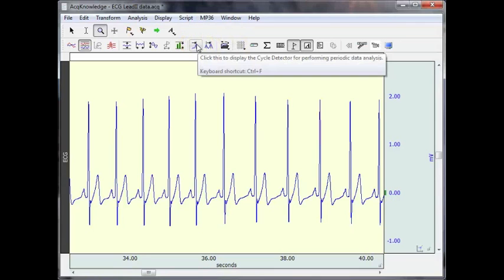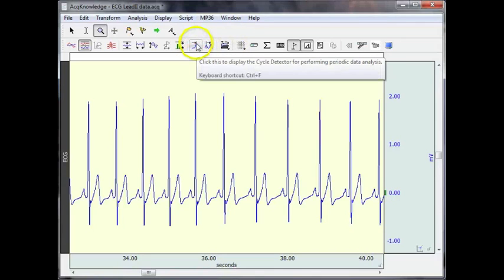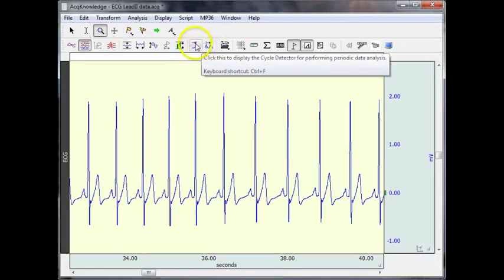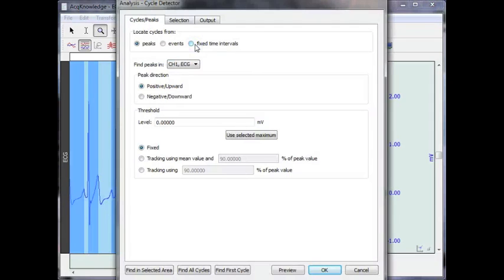Rather than going to the analysis menu, there is a toolbar icon. I'm going to select that.